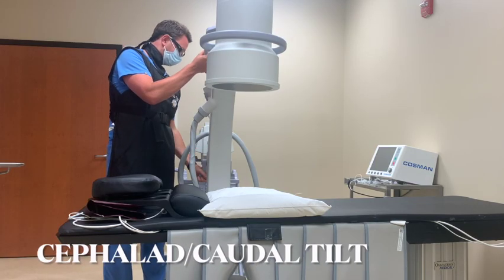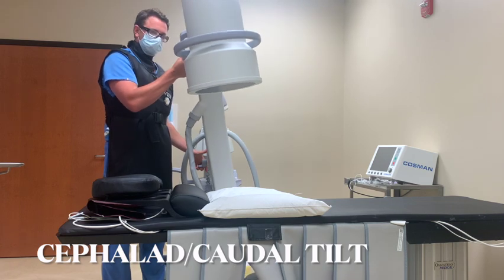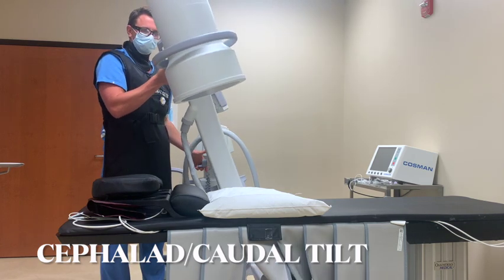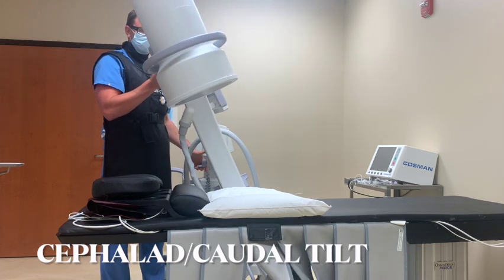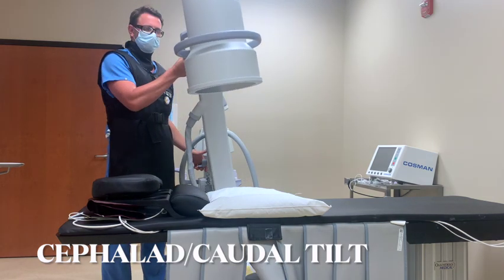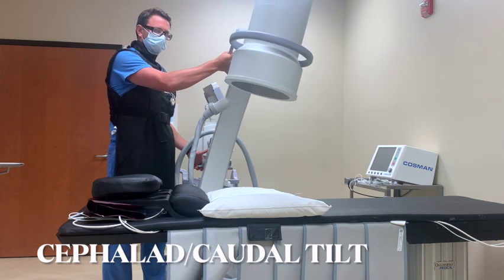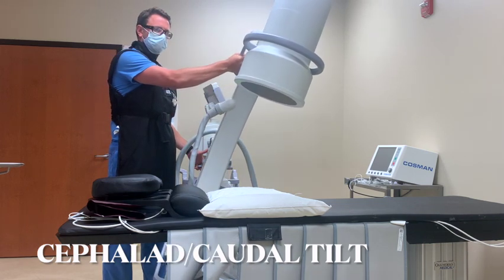The first movement we will display is a cephalad or caudal tilt. This is when the C-arm rotates around a transverse axis either towards the head — cephalad — or the feet — caudal — of the patient.